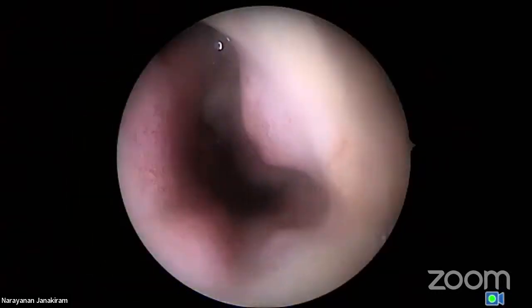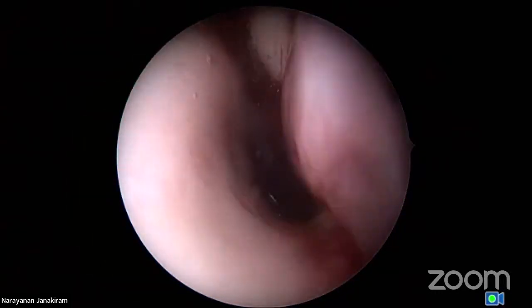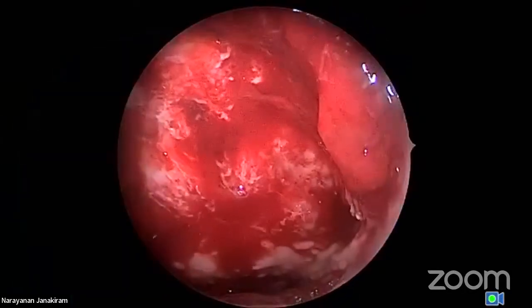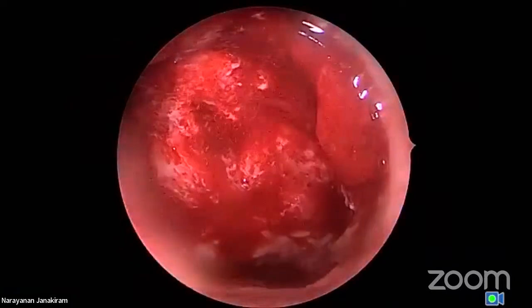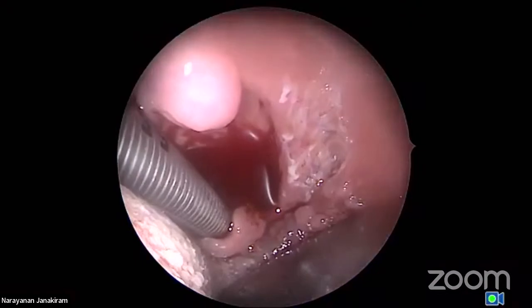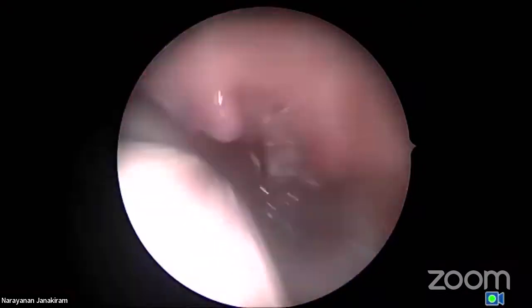Okay? Right. Now, let me have a look at what's happening inside, whether there's bleeding at all. Suction, there's no bleeding at all. Absolutely no. Of course, I want to make sure that there's no bleeding. Give me the nasogastric tube a little bit. So even that amount of bleeding I don't want. So I'll show you what I will do. Has it come down? No.